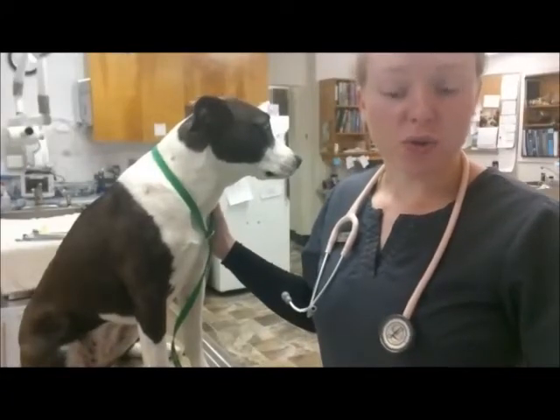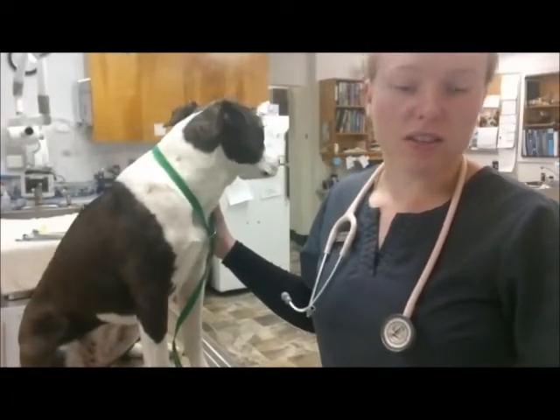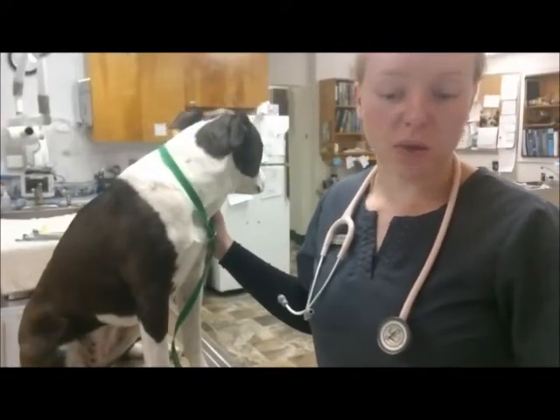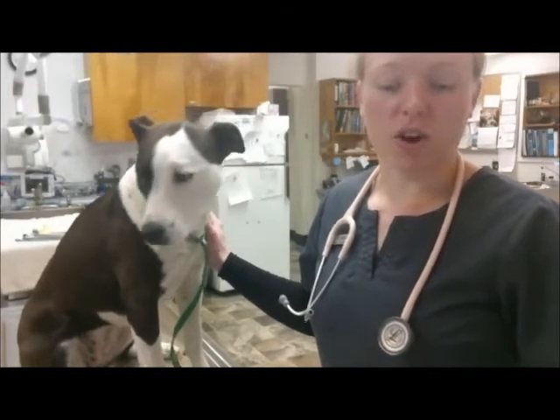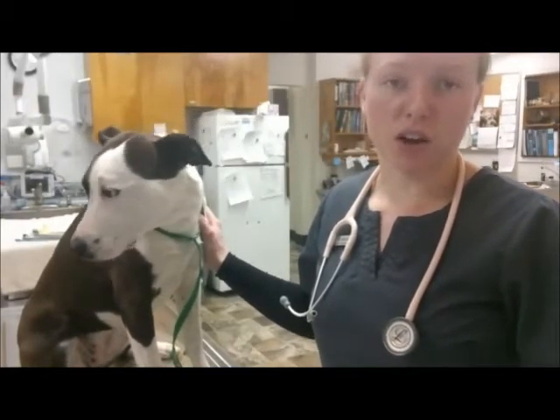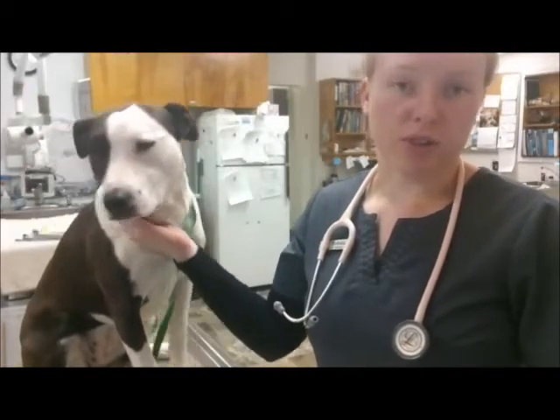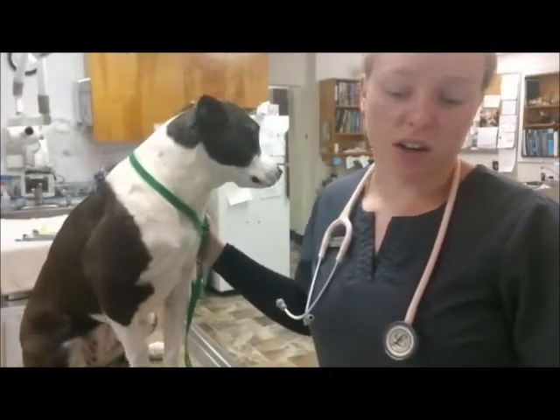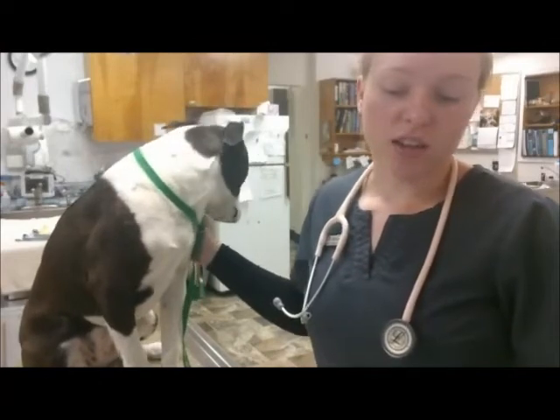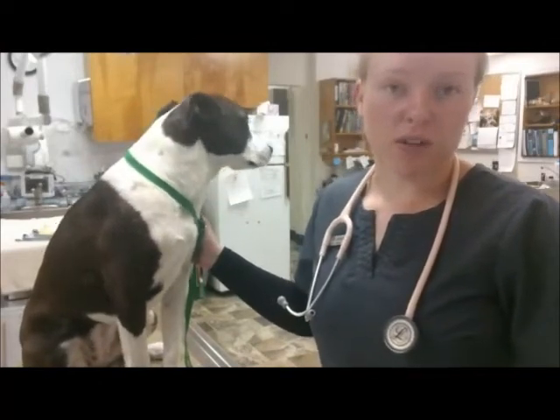A patient in respiratory distress should be assessed as soon as possible. A stethoscope should be used to auscultate the lungs in all fields on both sides. The patient's respiratory rate and effort should also be noted, and when you get the opportunity, you should auscultate the heart on both sides to determine if arrhythmias or murmurs are present.